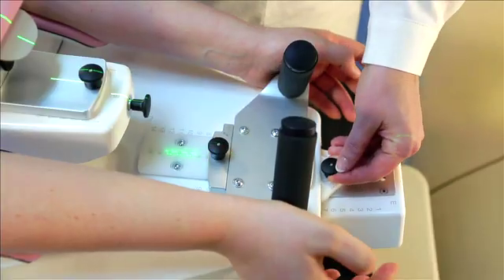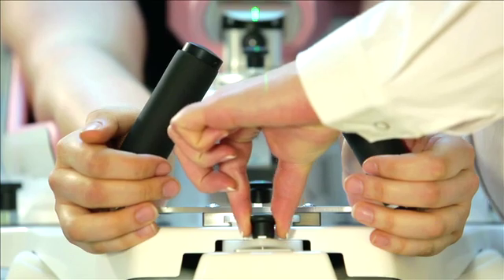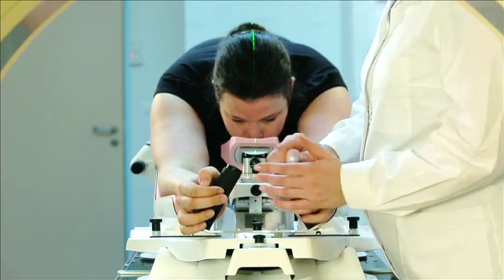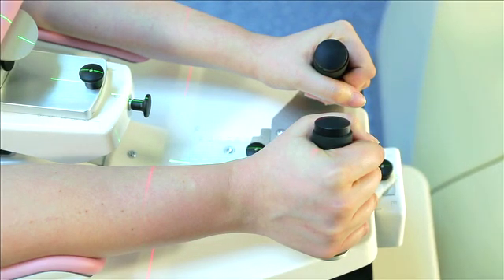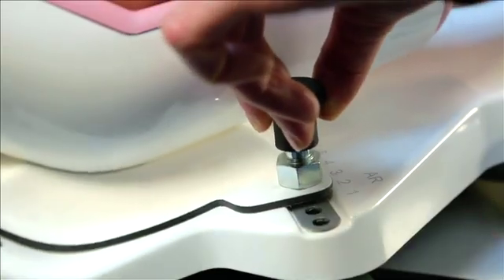When adjusting the arm support, make sure that the shoulders are in a relaxed position and that the arms are not covering the ipsilateral breast. When adjusting the hand grips, verify that the patient is able to hold the hand support in a comfortable way. The position of the elbow support can be adjusted so that the shoulders are in a relaxed position.